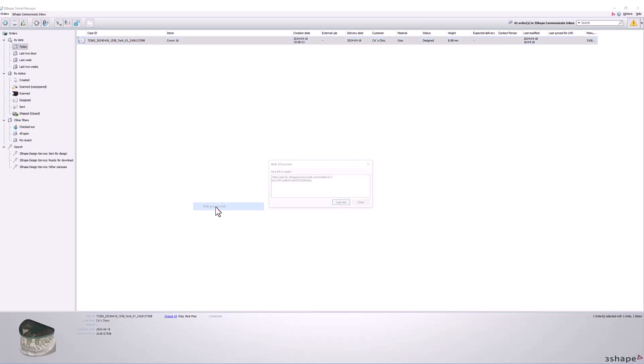A window will appear with an automatically generated URL where you can copy the link to share.